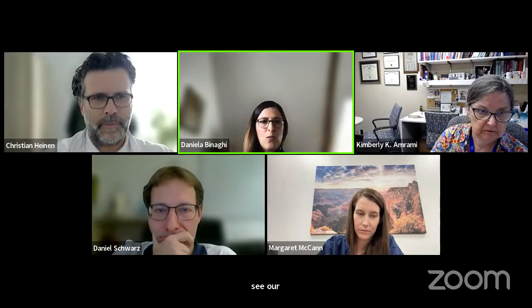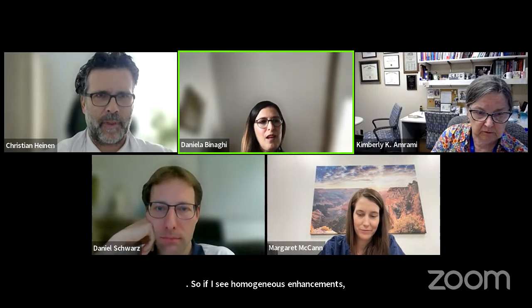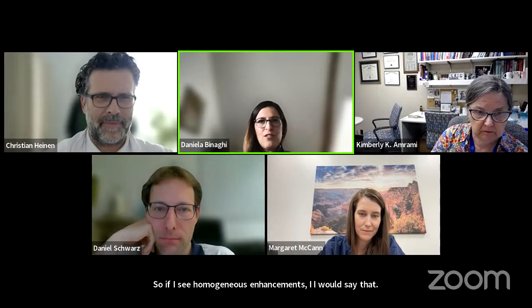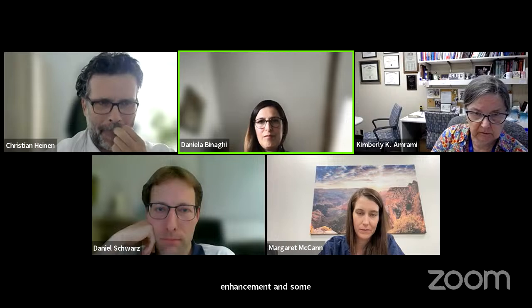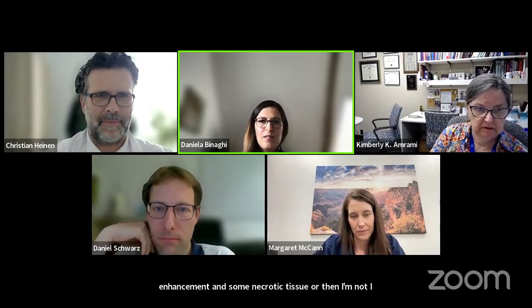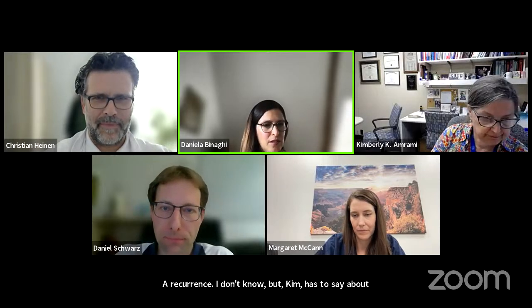So if I see homogeneous enhancement, I do not get nervous. But if I see heterogeneous enhancement and some necrotic tissue, I would say that is most likely recurrence. I don't know what Kim has to say about it.